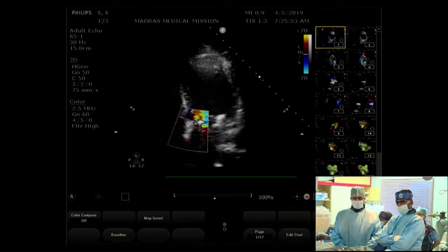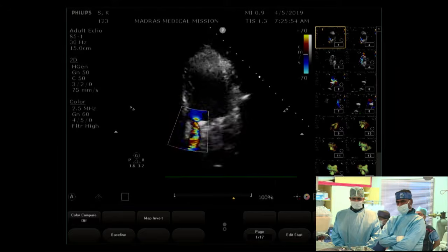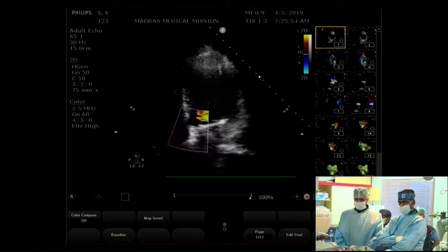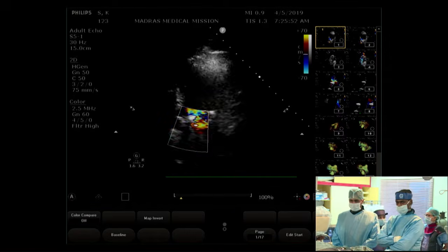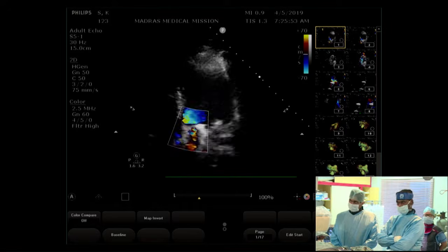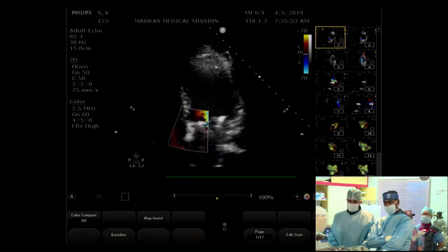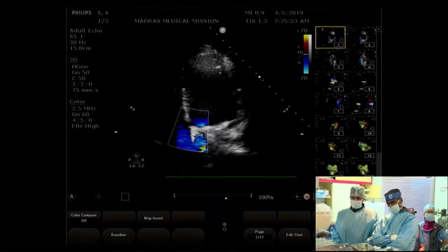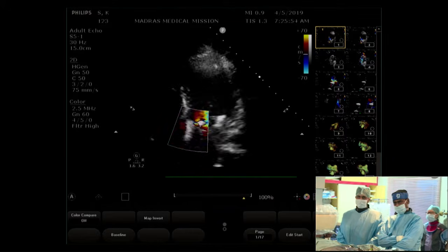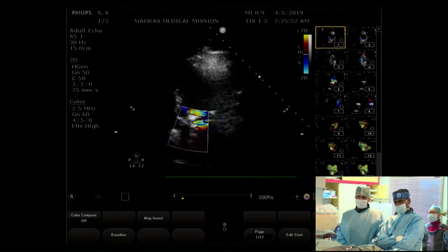Hi, I think that's exactly what I would do. It's such a tight angle to get around that a transapical approach makes this way faster and the fluoro time way shorter, and secondly, you'll need a really big device. So if you were to come through the interatrial septum with a great big diameter sheath to deploy a big device, it'll be hard because of that angle to orientate the device if you're using a non-round device. And I think this is a much better way of doing it.